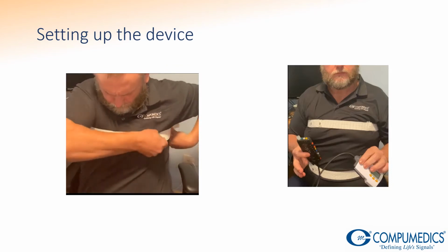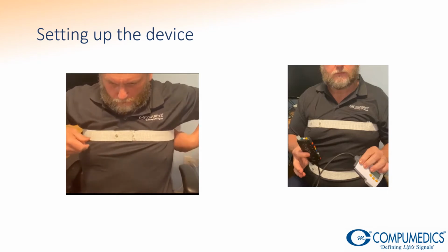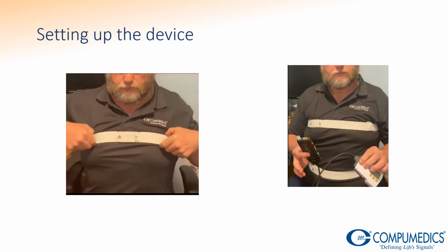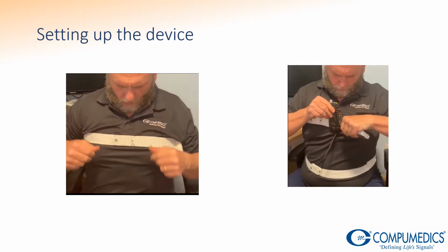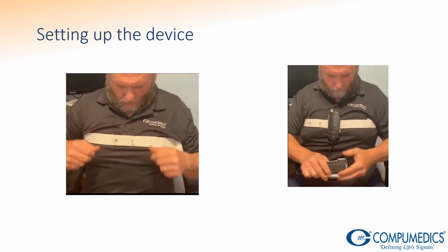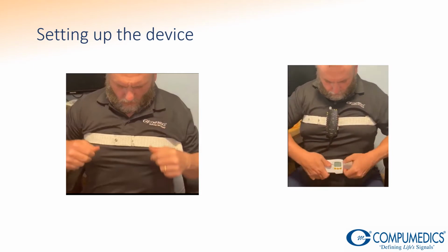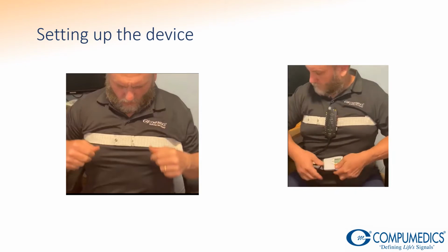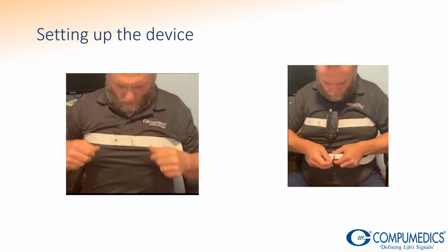Position the belt with the clips on the front facing forwards. Making sure it's not too tight. And as shown, the PIB grey unit sits on the top belt in the middle, while the recorder can be clipped over the belt or fed through the belt. With the white belts, we recommend a small piece of tape just to hold those together.